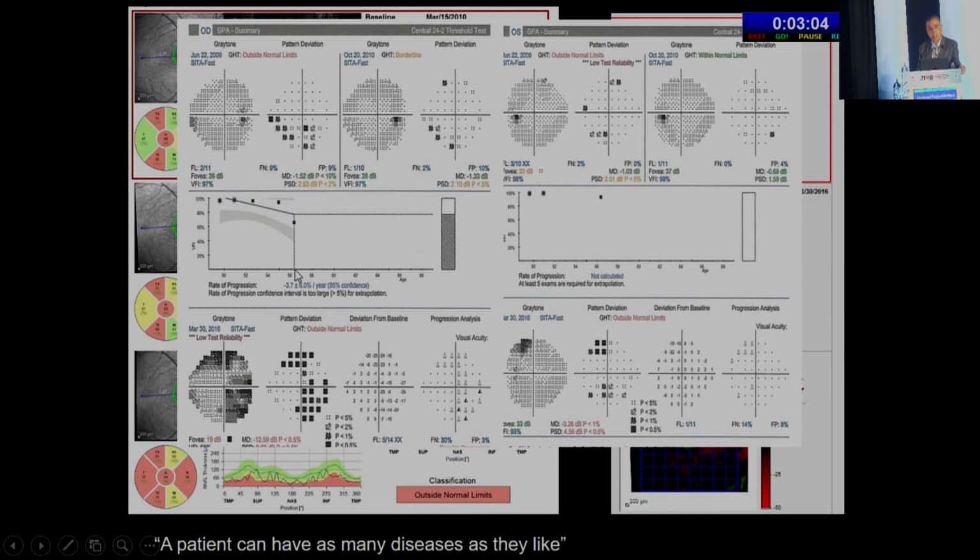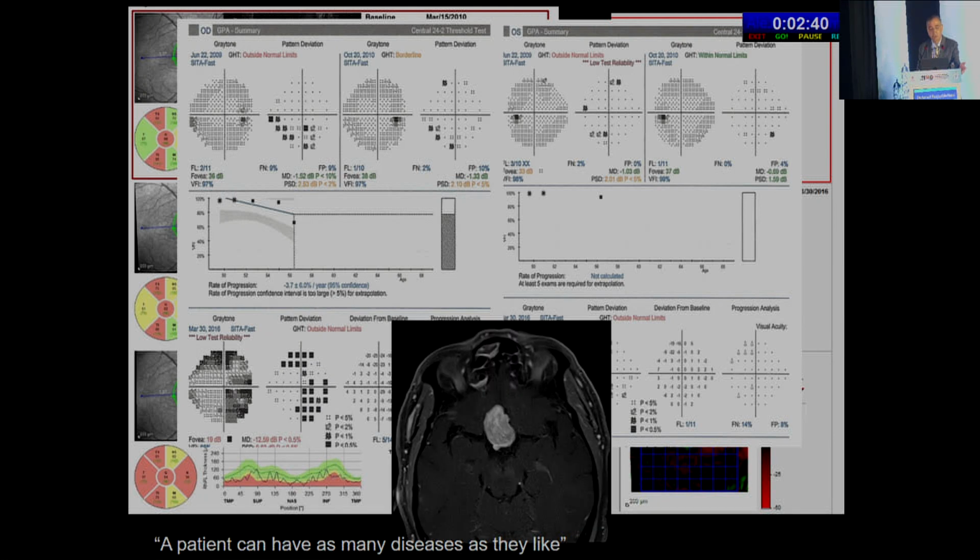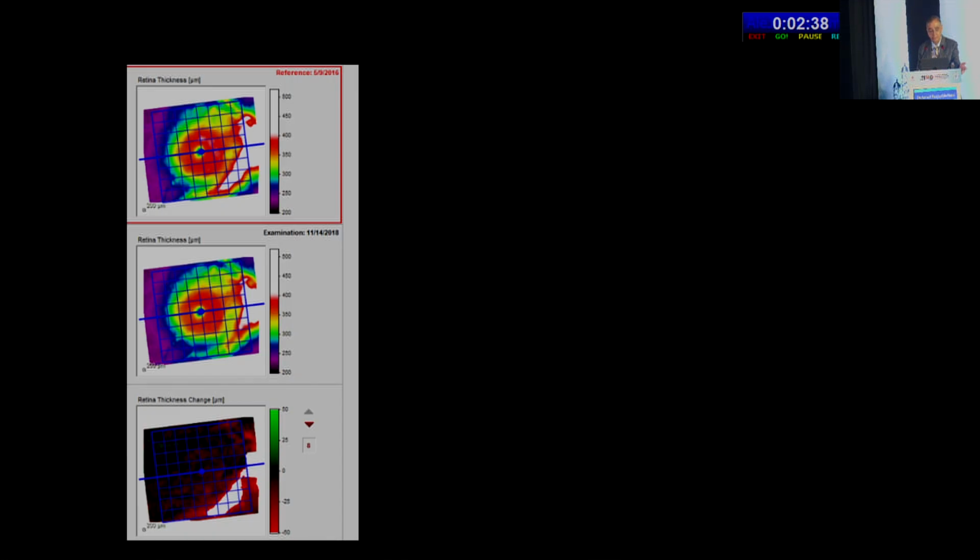This patient does have glaucoma, but the visual field is getting worse. How many of you are able to notice the pattern of bitemporal hemianopia in this? You can see there is a loss on the other side that's respecting the vertical midline, and on this side also. You don't always get the textbook vertical midline picture. And sure enough, it was a big pituitary tumor.